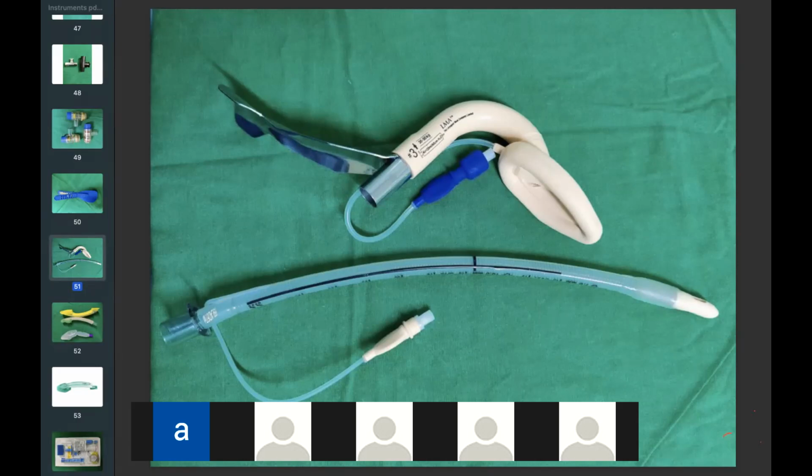And Garima, remember that the tube which they give is basically a reinforced flexometallic tube. Like your flexometallic tube, because it has to pass through the curve and you don't want it to kink, correct? Yes. And if I'm not mistaken, a new company has come out in which once you have passed in the tube, the outside LMA can be peeled off. So that whole action of putting in the tube and then removing the LMA is not there. I couldn't get a picture of it, but I think that has just come in the market. So if I see something, I'll let you know.